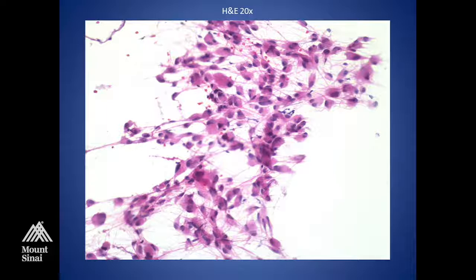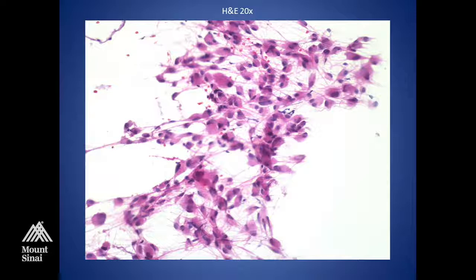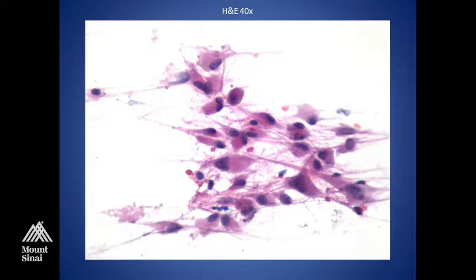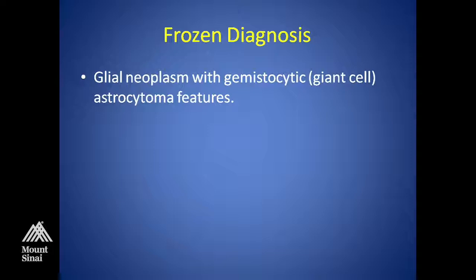These cells do have fibrillary processes. The nuclei are relatively eccentrically located with an abundant amount of cytoplasm and thick fibrillary processes. I like going to areas where there are not many cells so I can really get a good impression of the cytoplasmic border and whether it's a smooth or fibrillary edge. On frozen, this was called a glial neoplasm with gemistocytic giant cell astrocytic features — that's all you really have to say.